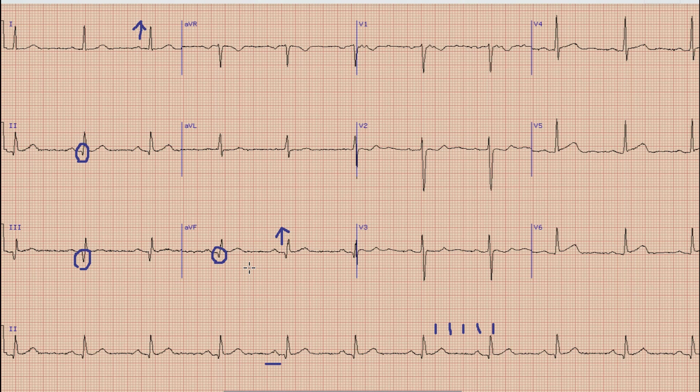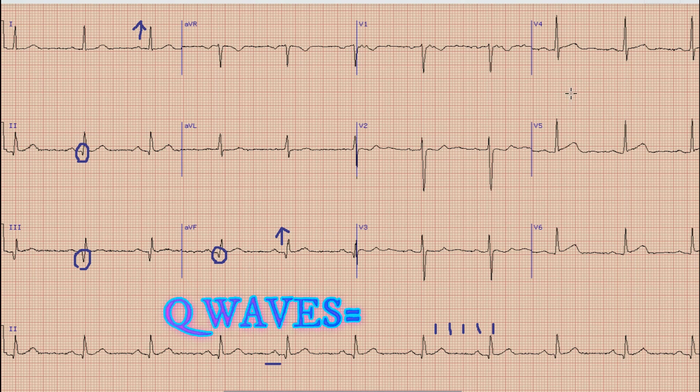If you remember from one of our previous videos in which we discussed the significance of Q waves, we learned that the presence of significant Q waves means there is a possible history of previous myocardial infarction.